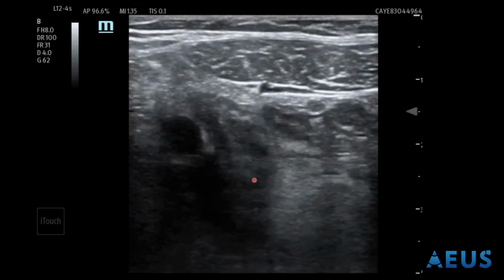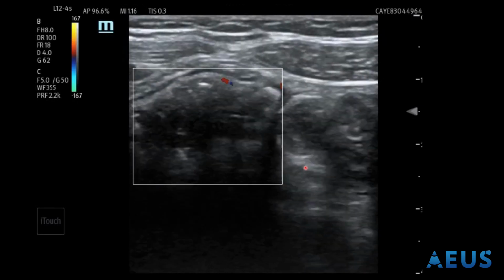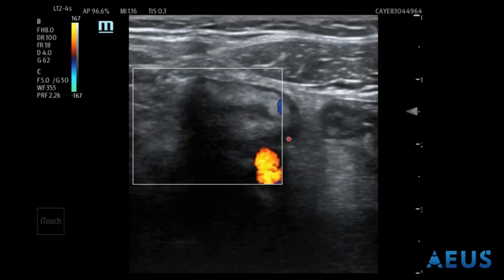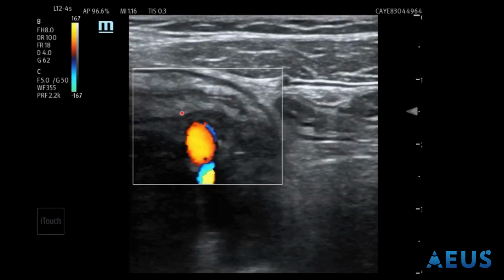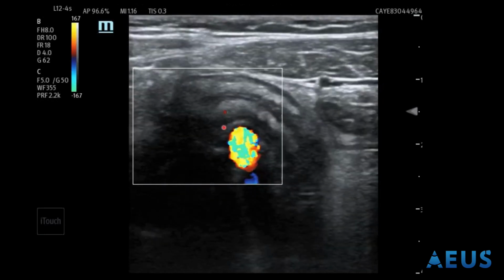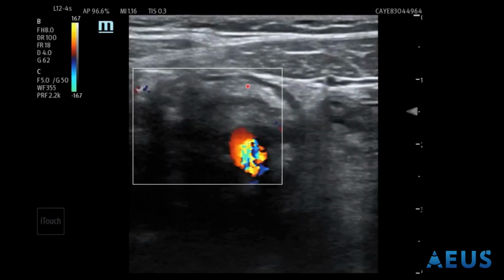Looking through, here you can notice, again with color flow, the vessels and the structure coming right off the cecum. Right here, you can notice 3 distinct layers.